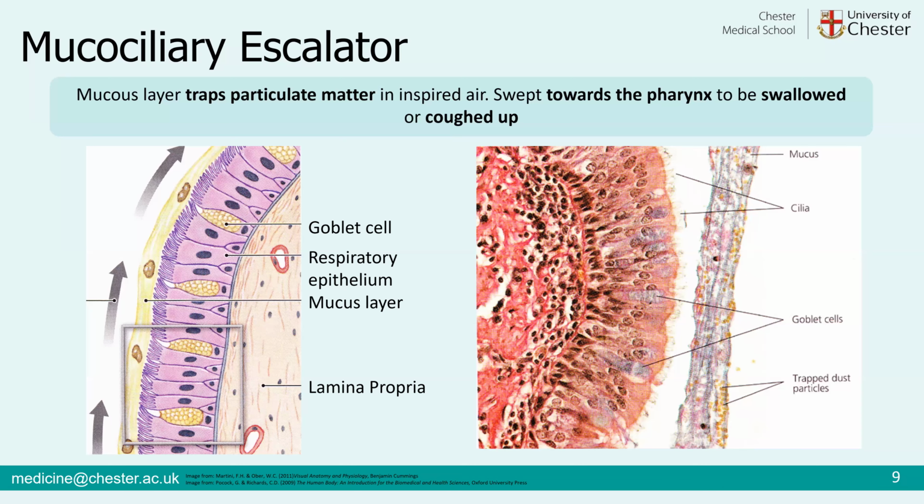There's a gap between the two. Well, those cilia need to waft the mucus. They're not going to be able to do that if there's a big gap. This is an artifact, so it's not like that in life. It's like this in life. The cilia can actually waft that mucus. There's not this gap. This is just introduced because of the processing the tissue's gone through. It's important to bear in mind when you look at tissues if there are any common artifacts that can be introduced into that tissue, to make sure that you're not misinterpreting what's going on.